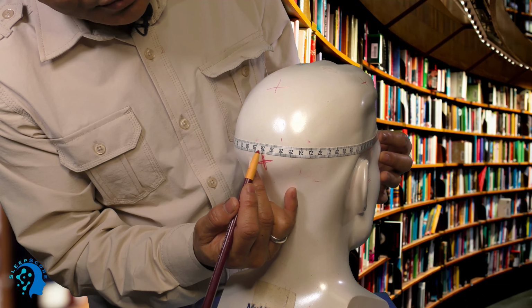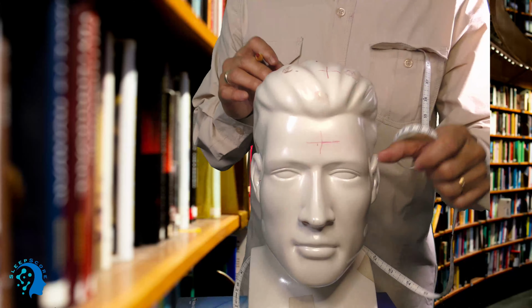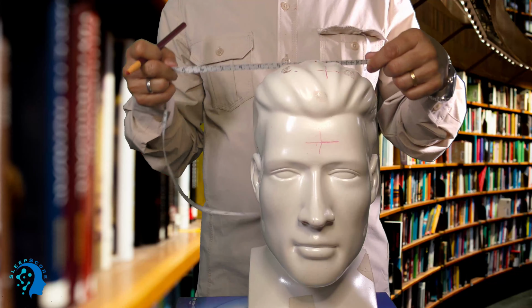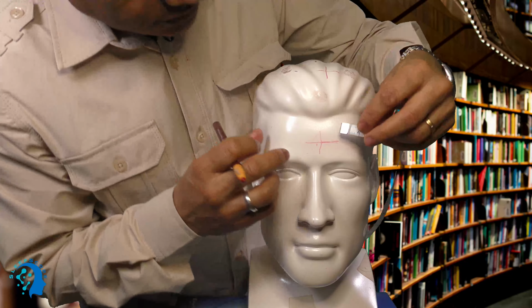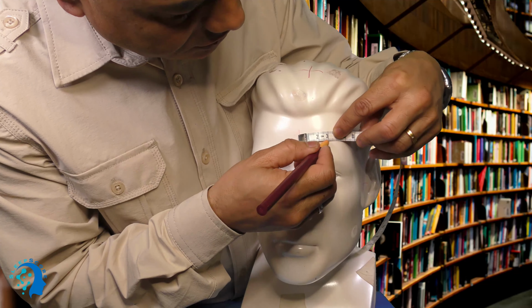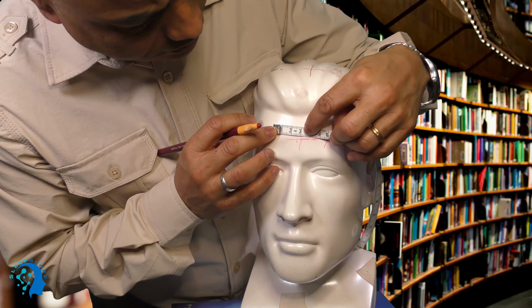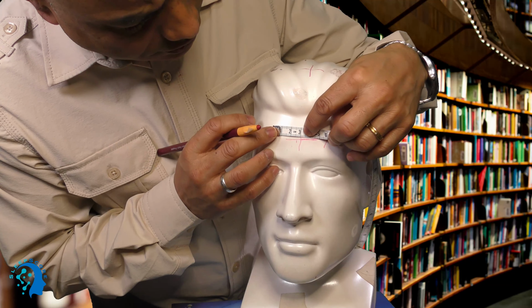Now in that way, what happens is, this is O1 on the left side, this is O2, this is Oz, but we don't need Oz. But anyway, the same thing I'm going to do on the front side also. I will go 2.8 on either side. So from here, I go 2.8 right here, see, and I go 2.8 on this side also.